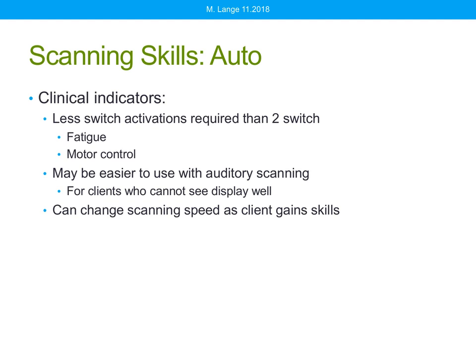Compared to two-switch scanning, which we'll talk about in a minute, auto scan requires less total switch activation, because instead of using that second switch to keep moving the highlight along, to move through our selections, this is done automatically. This can be important for some of our clients, because the amount of times required to get through their vocabulary can quickly lead to fatigue. It can even lead to an increase in muscle tone, and either fatigue or increased tone can reduce motor control.